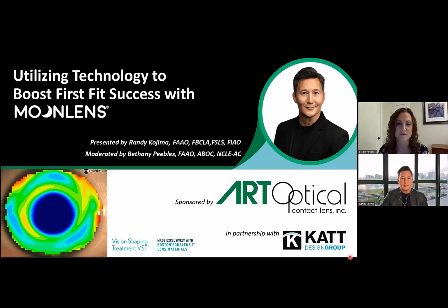I'm the Executive Director of the Consultation Department at Art Optical, and I want to thank you for joining us this evening for the final event of this educational series. So tonight we are going to be talking about utilizing technology to boost your success, and we have Randy Kojima here with us this evening to talk about that.